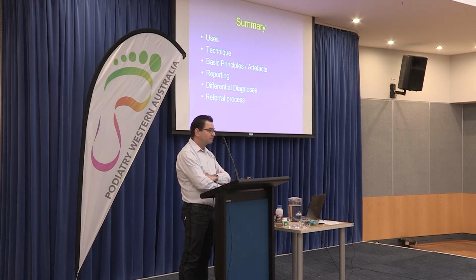The scarring and the aponeurosis that you were talking about, is that visual on MR? Yeah, but I wouldn't do an MR first up, but yes, it shows up really well on MR.